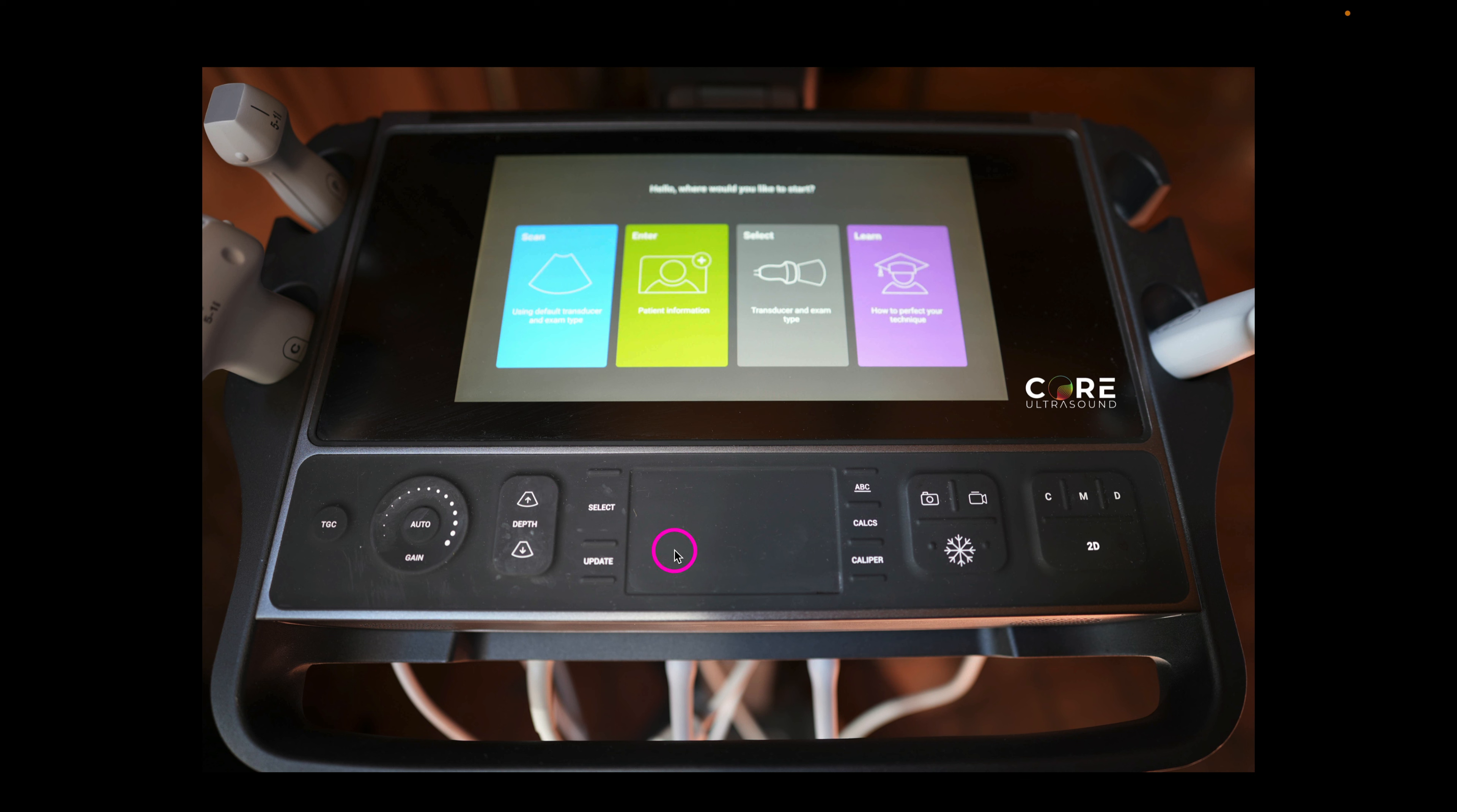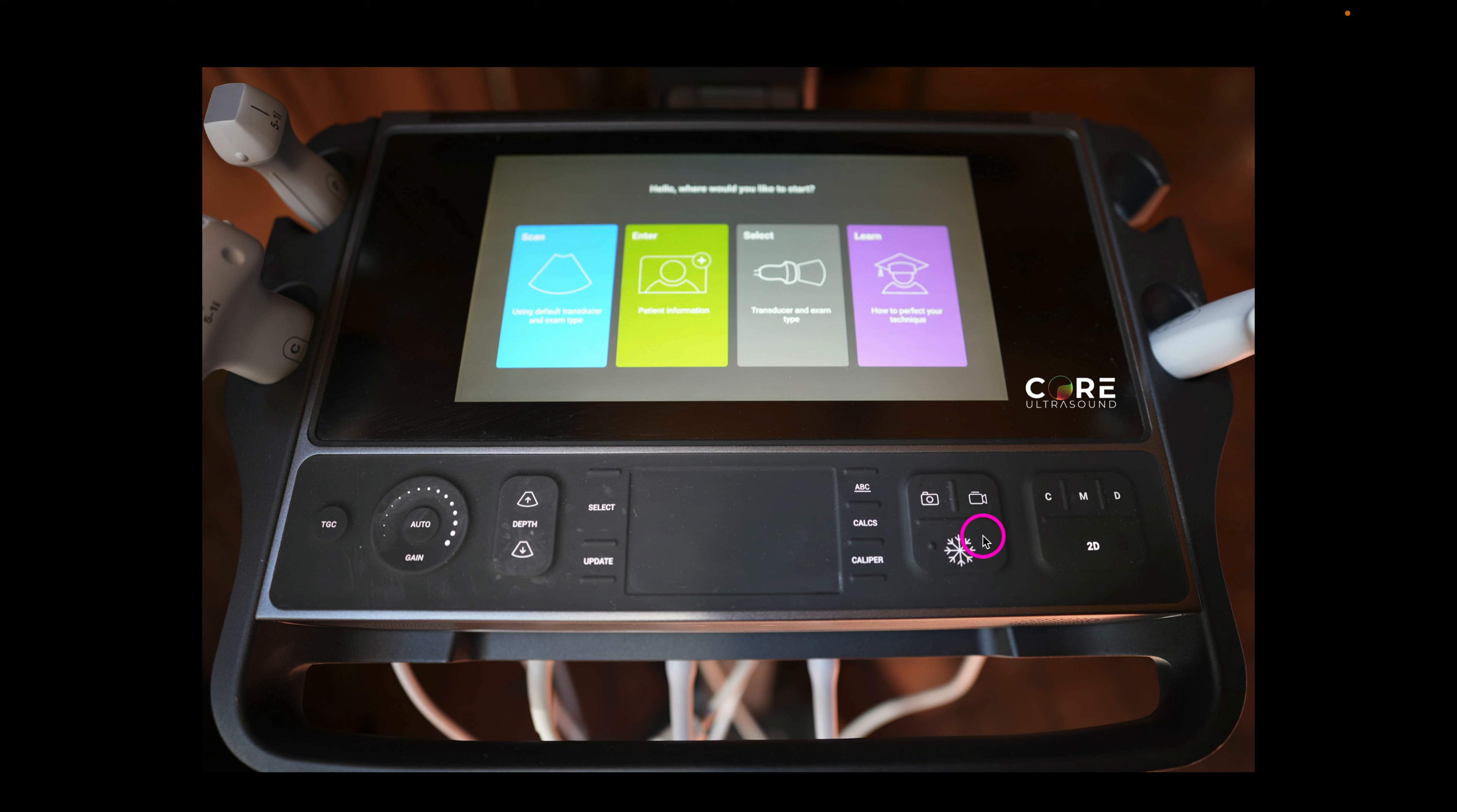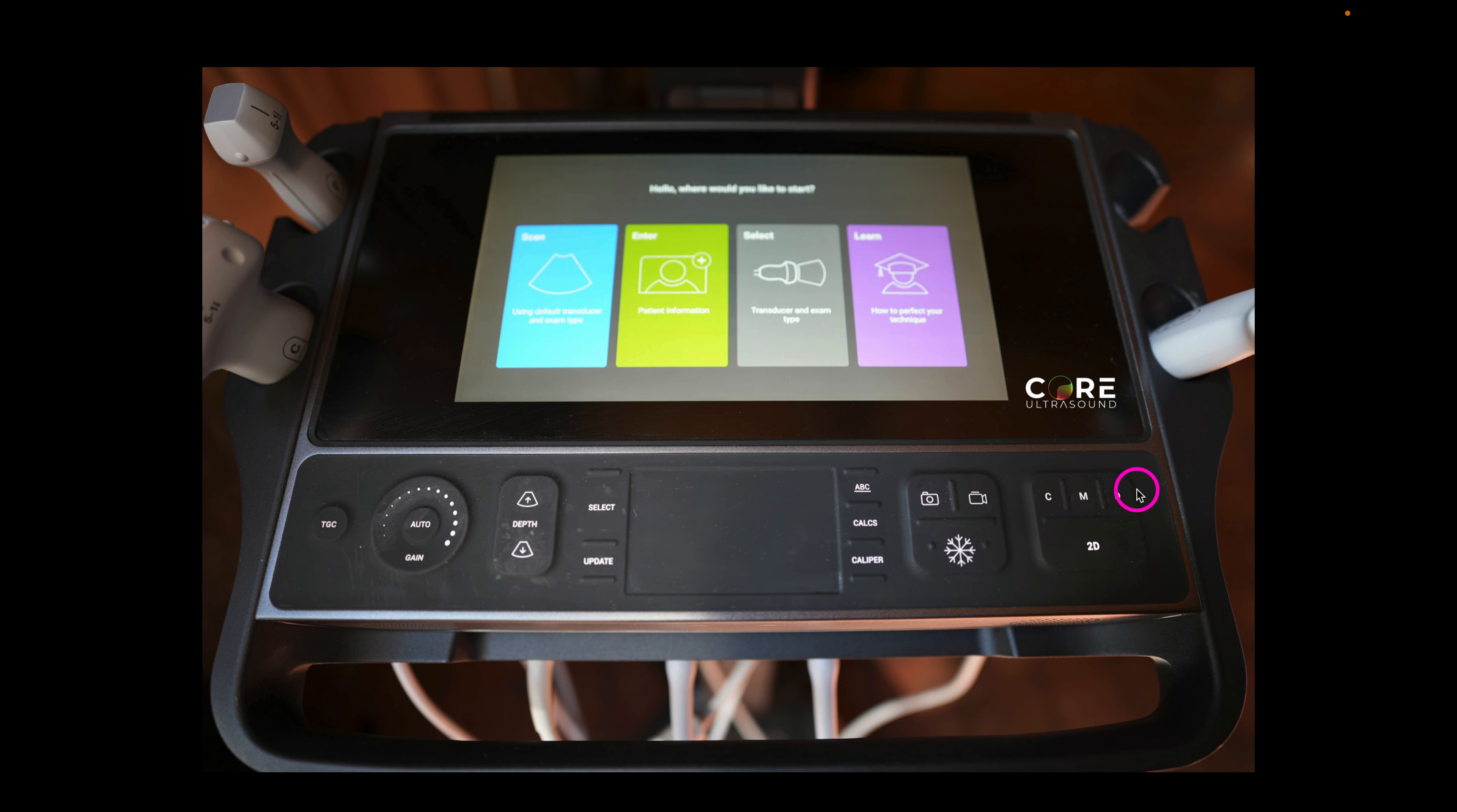We have the mouse pad here. We can select, we can put in annotations, access calculators, access calipers for distance. This right here is how we record clips. This is how we take a screenshot. This is how we freeze an image to do calculations or distances, which you see here. And then over here selects the mode of the transducer. 2D is our grayscale. This is what we typically use, but we can also use color Doppler. We can use our M-mode and we can use our pulse wave Doppler by hitting these respective buttons.